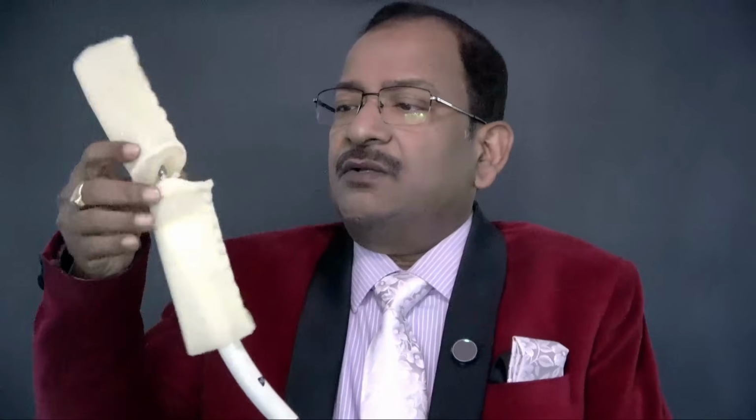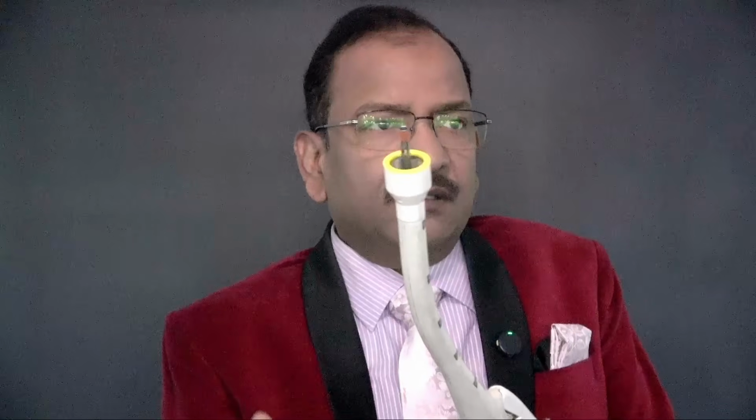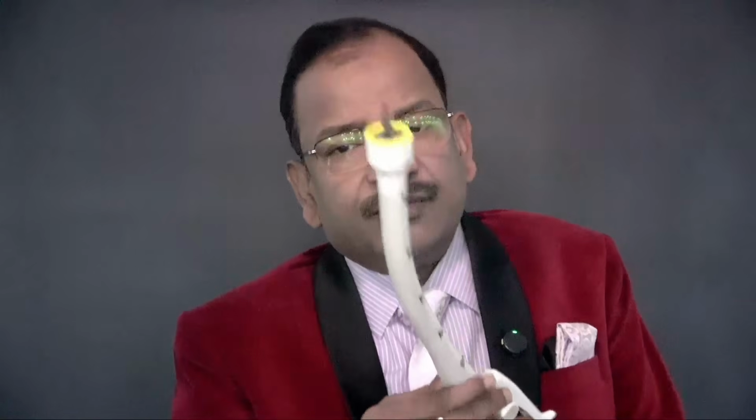The gun also is single use because here the problem is that staples are not in the anvil, staples are on the gun. So if I show you here, these are the holes for the staples. So the company is making it in such a way that they don't make a separate cartridge, just to make money. They put the staples in the gun part, so this entire unit has to be thrown. And that is required for end-to-end anastomosis.